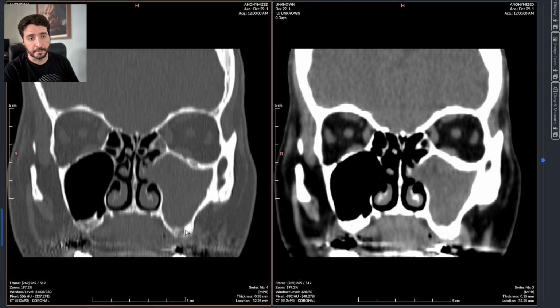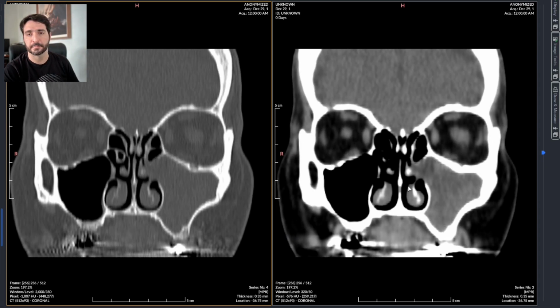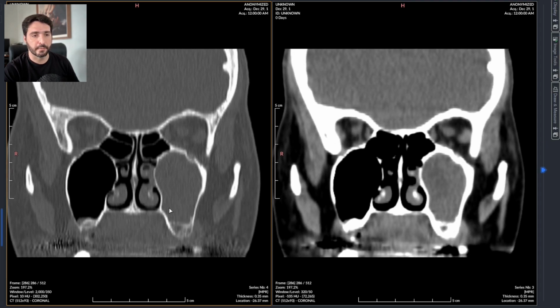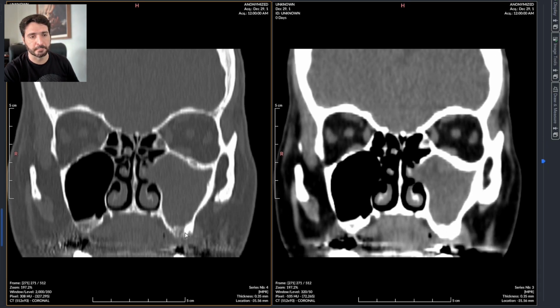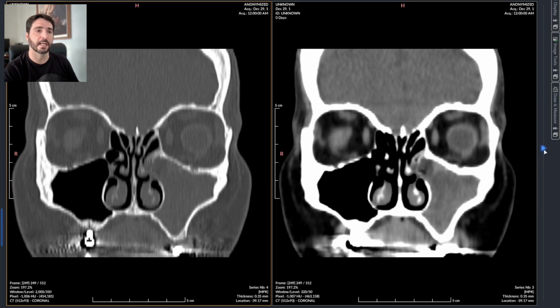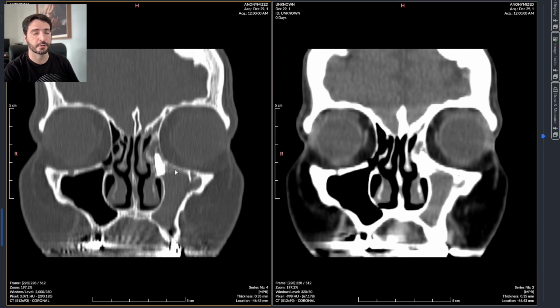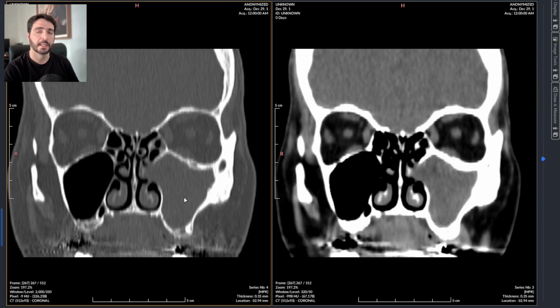right here on this kind of fractured and partially repaired bone of the maxillary alveoli. I don't actually know how to pronounce that properly, but it was right here, and it was dislodged, it moved, it broke the bone and traveled upwards and inwards, and it got stuck at the outlet of the maxillary sinus, causing the obstruction that led to the chronic sinusitis.